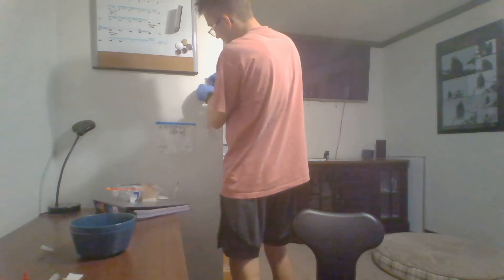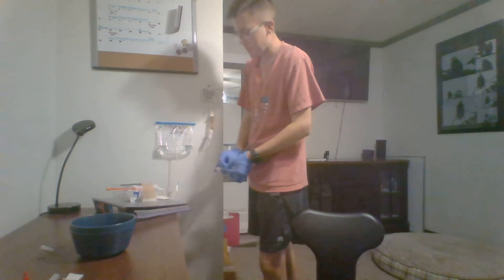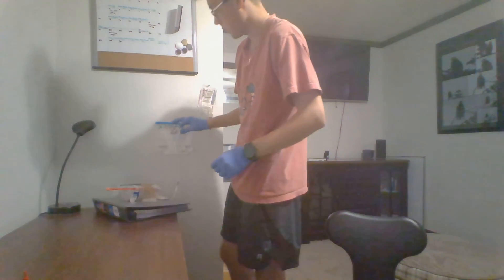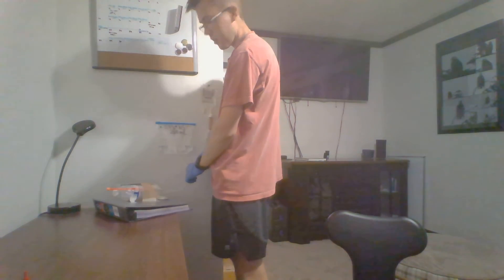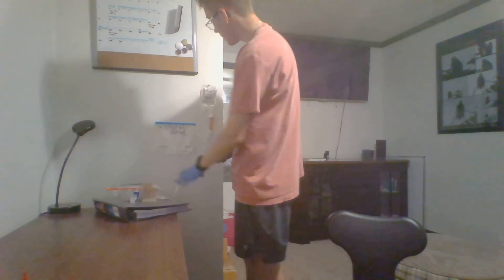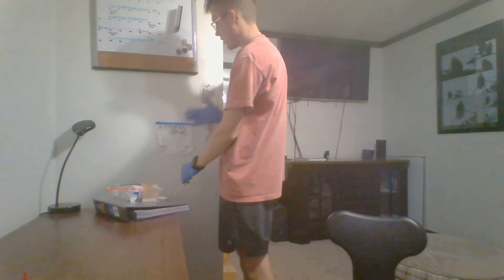After I have finished priming, I am going to hang this bag higher than my primary line. I'll then grab a new alcohol prep pad, come over to my primary line, find my Y port, and clean off the Y port. Then I'll check my medication one more time to confirm it is the right medication.